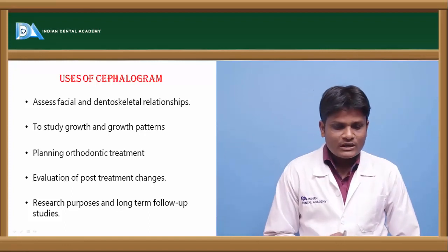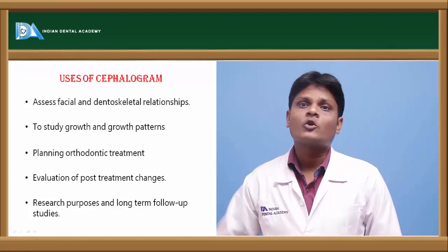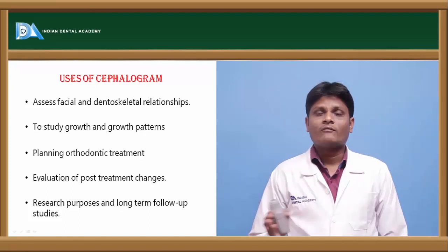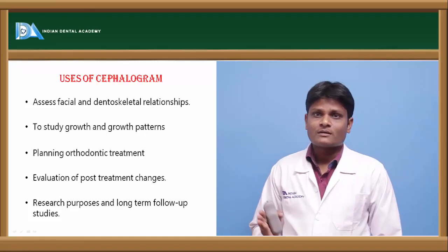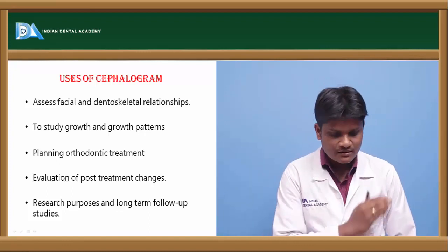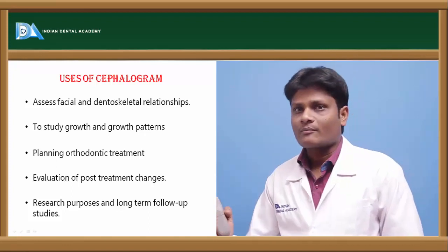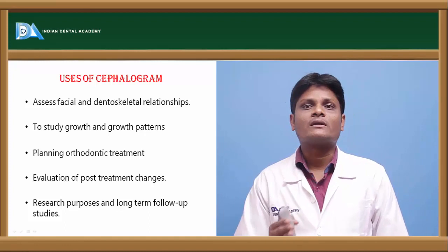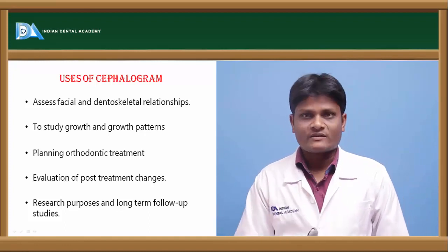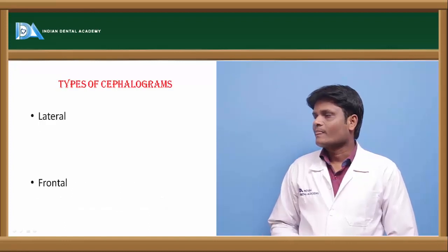Now, lateral cephalograms are also used for research purposes in long-term follow-up studies. As I told you before, when we carry out growth studies, lateral cephalograms are of great importance because we can assess the growth increments as well as the growth pattern of the patient over a period of time. So they are very much useful in long-term growth studies. So these are some of the important uses of lateral cephalogram.